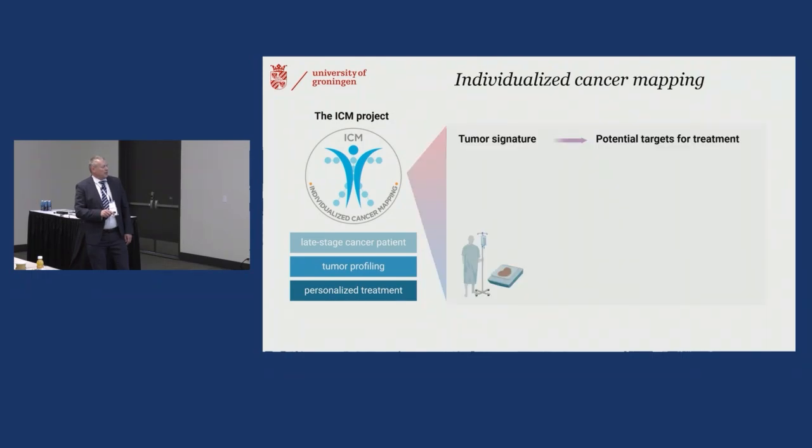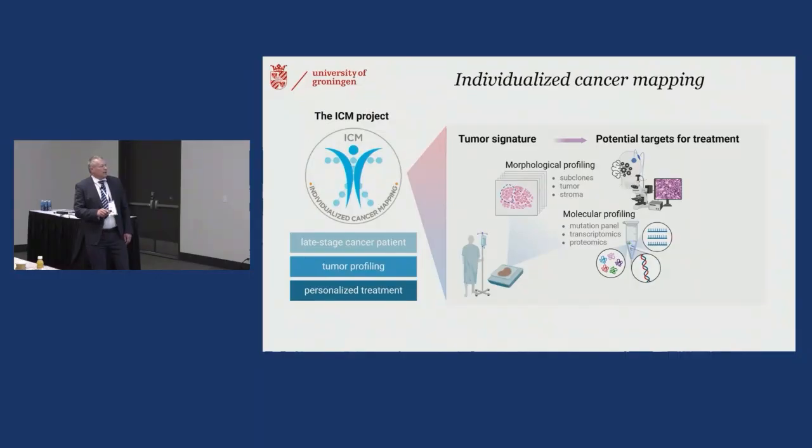You get the patient material, which is a tissue. Then we slice the tissue, and one of the slices goes to digital pathology assessment, where a trained pathologist, or now we are using AI for that, assesses different pathological scores and characteristics.